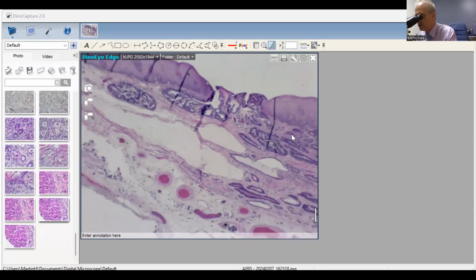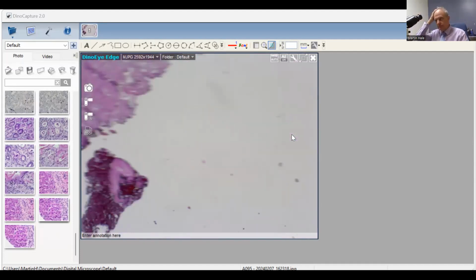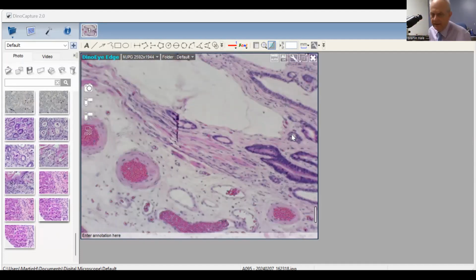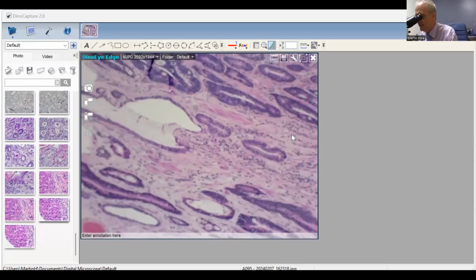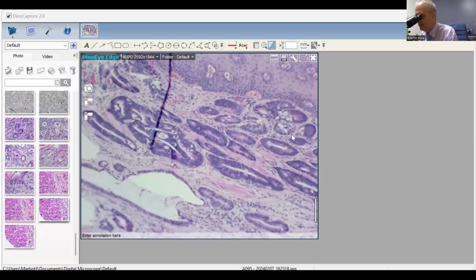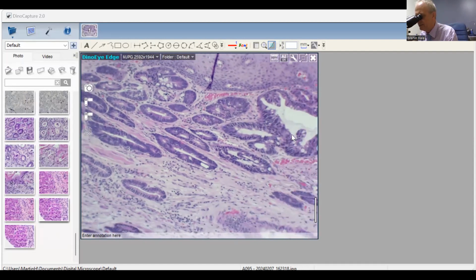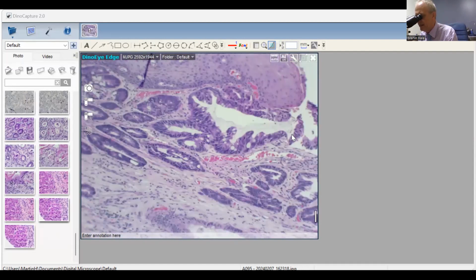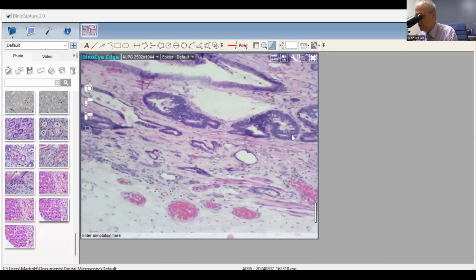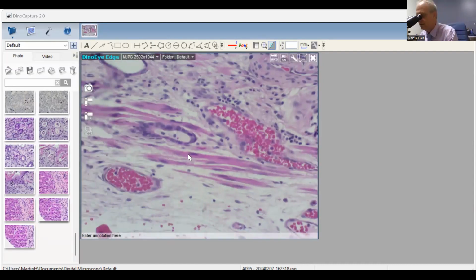Hence the need to make sure that you go through. As he said, don't say, yes, there's the Barrett's, and move on. The 1 minute rule per centimeter, very good answer. So there it is, the infiltrating adenocarcinoma, which is undermining the Barrett's. And here you can see the tumor actually infiltrating between the fibers of the muscularis mucosae.